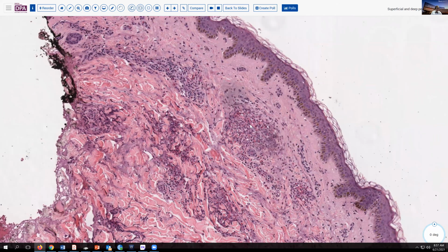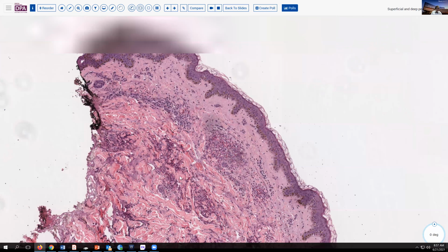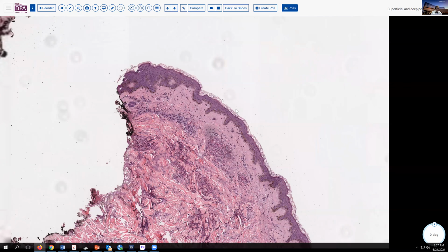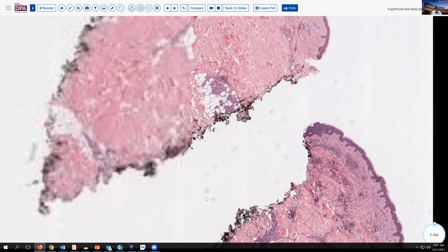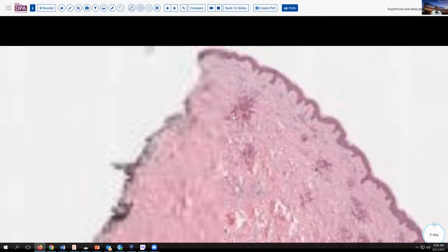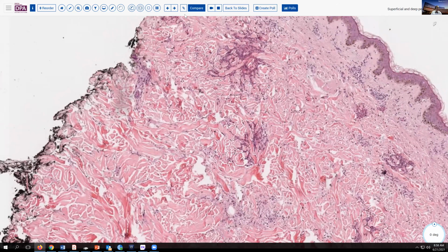But we can see a little bit of the so-called flame reaction that these types of insults can induce with these little sort of micro abscess type changes amidst the inflammatory process as well. So two similar examples of the same type of reaction to the foreign introduction of the arthropod mouth parts to take a blood meal and again produce this little flame type of reaction.